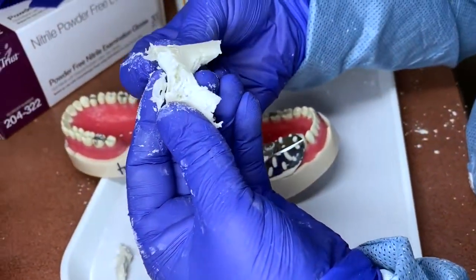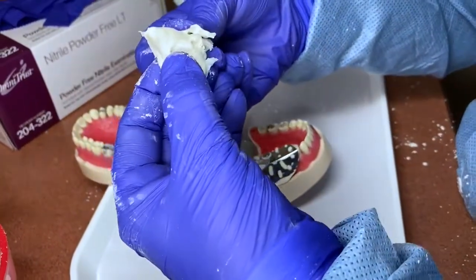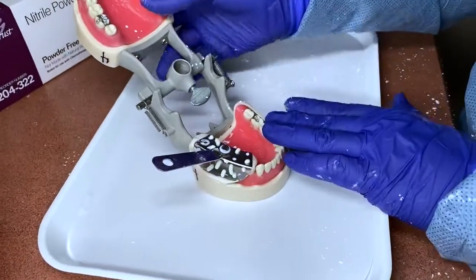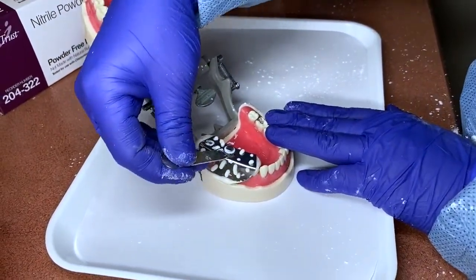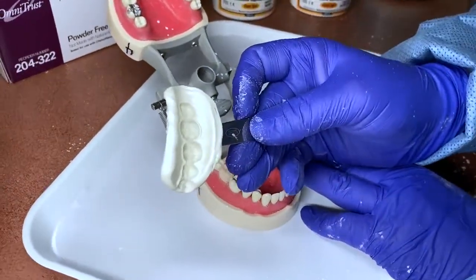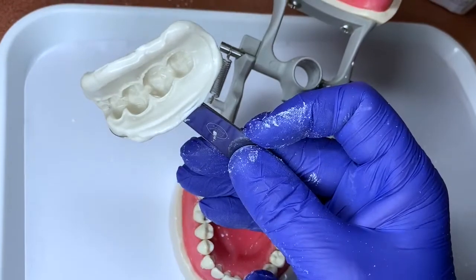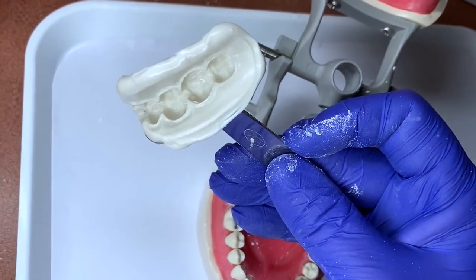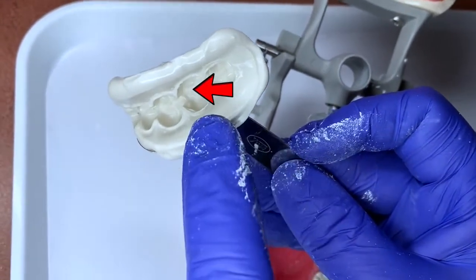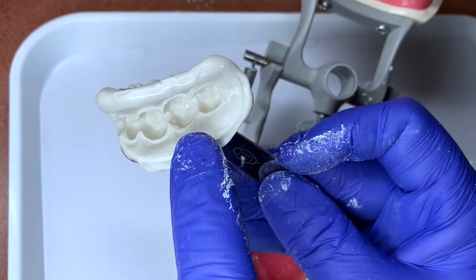See how it's getting to that rubbery state — that's how you can tell it's set up and ready to remove. When taking it out, rock it from side to side to loosen it, then remove it. That is a perfect impression. Keep in mind there are three and a half teeth in the impression, but we're only doing number 31, so we'll only put temporary material in number 31.